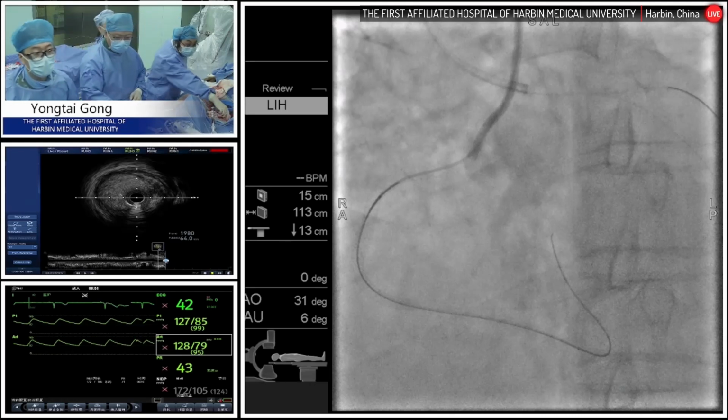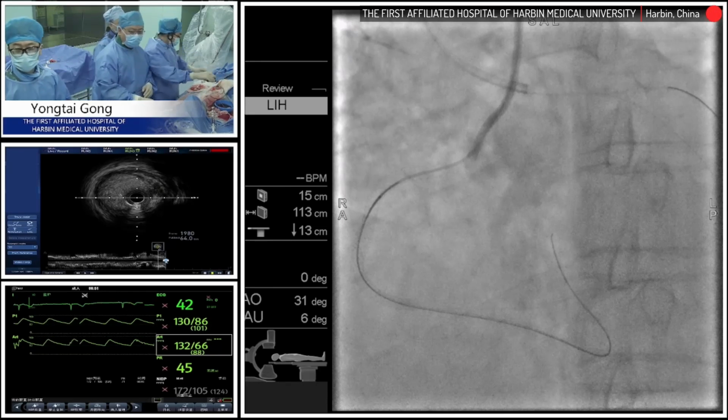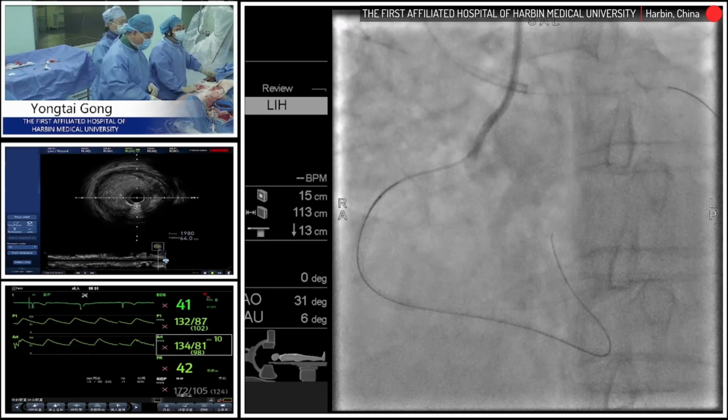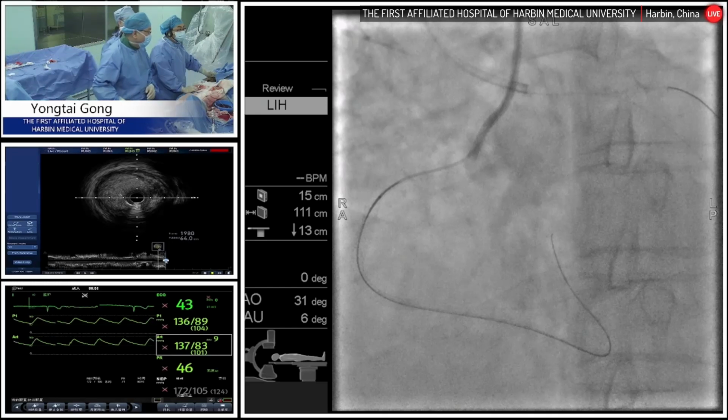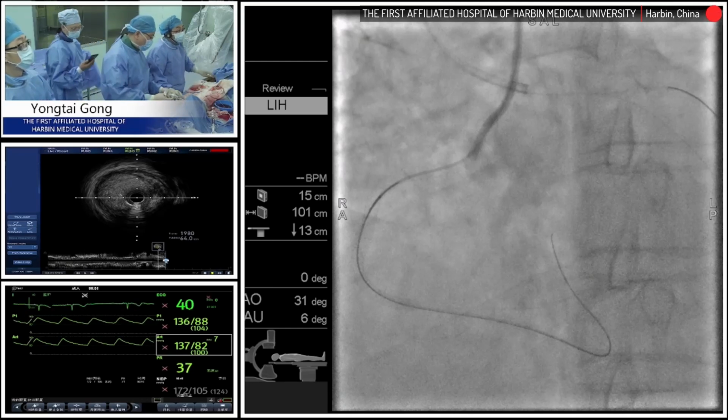Atropine. So we can see that this kind of medication is often used in clinical practice. We need to pay attention to the retrograde flow as well as the antegrade flow. Okay, let's check some questions from the audience.